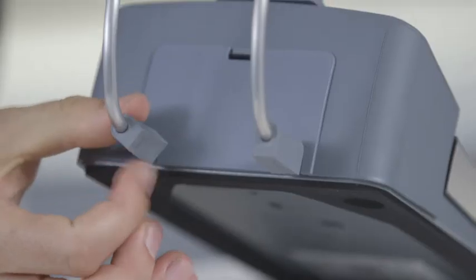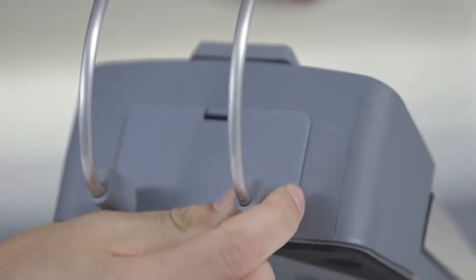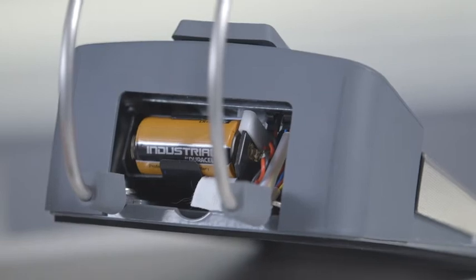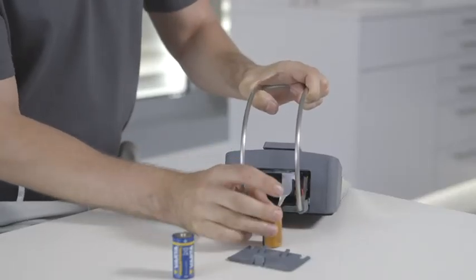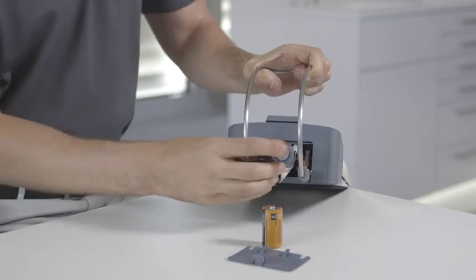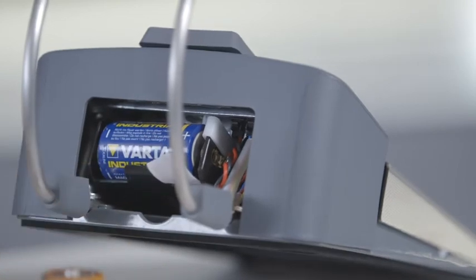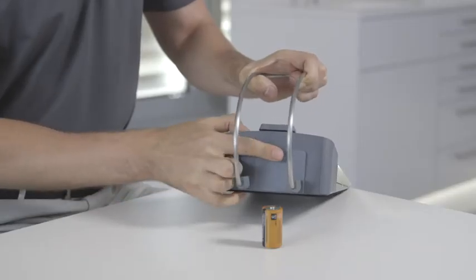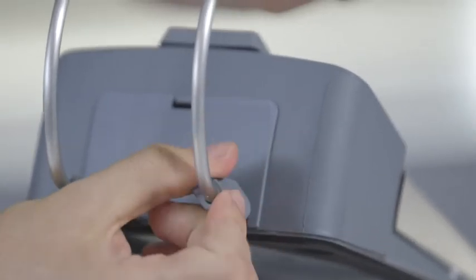Move the adjustable feet outward slightly by rotating them. Open the battery cover. Pull the battery out of the battery compartment by pulling the cloth strap and replace it with a new one. Be careful to insert it with the correct polarity. Close the battery cover and move the adjustable feet back.